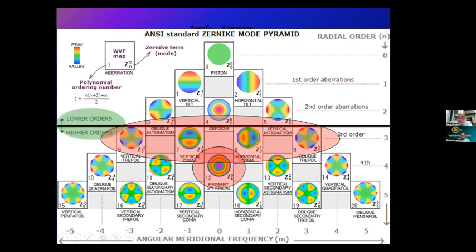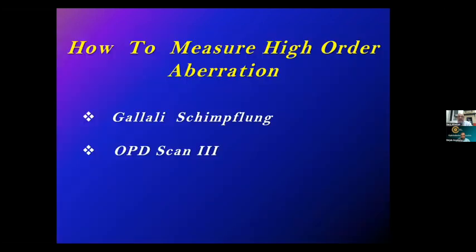Why do we call it fifth? Because there are five, and they are divided into right and left. The one on your left side is the oblique, and the one on the right side is the cardinal, which is vertical. And in the center, we said the defocus before, and once you go down, it is the spherical aberration and its degrees. So this is just to understand what that means.